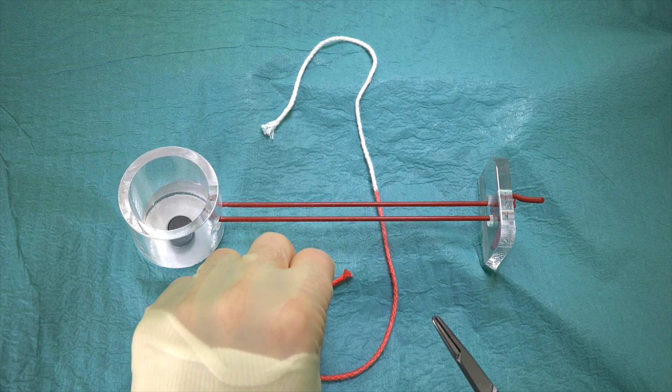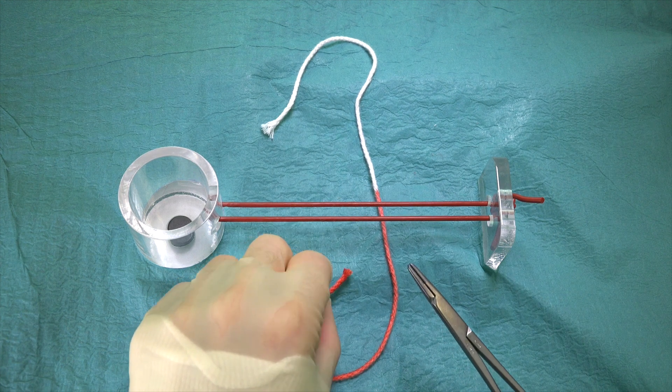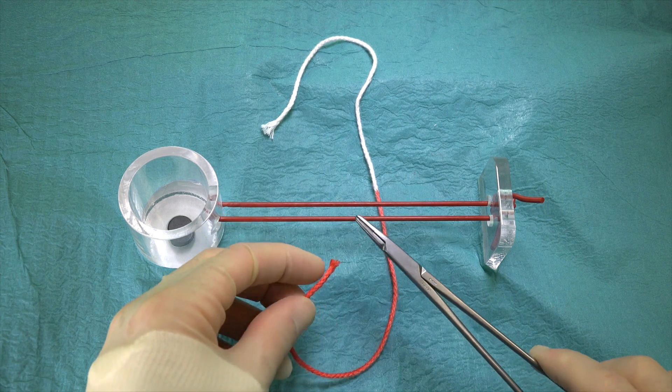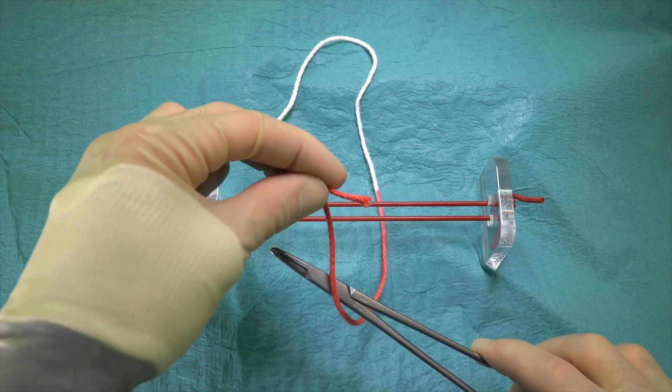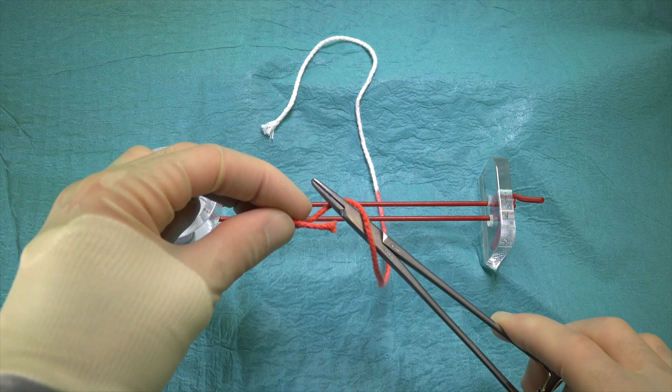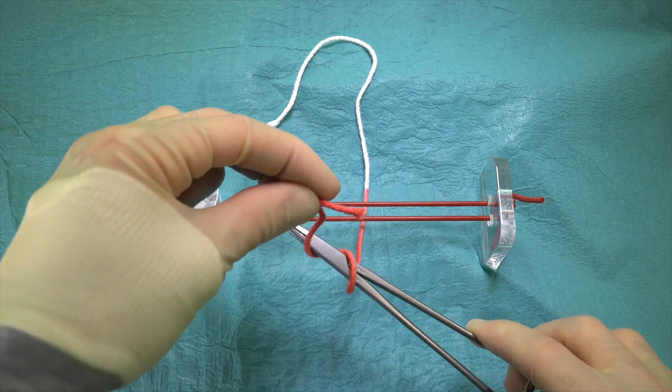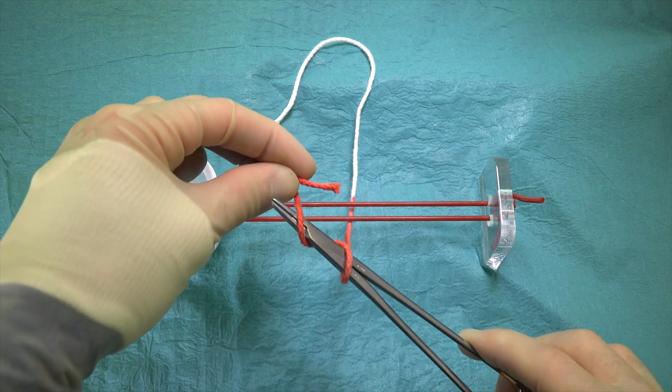We start by holding the end of the suture closest to us in our left hand. The needle holder in our right hand is held out horizontally over the suture. The left hand then loops the suture up and over the instrument, on this occasion twice as opposed to once as we would for a normal Reef Knot.